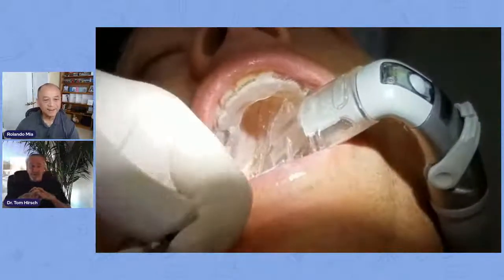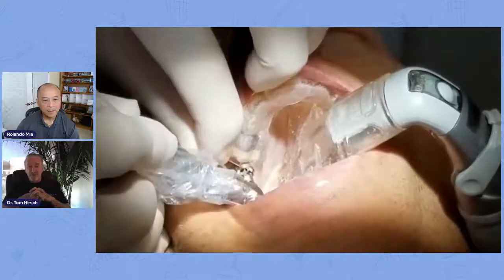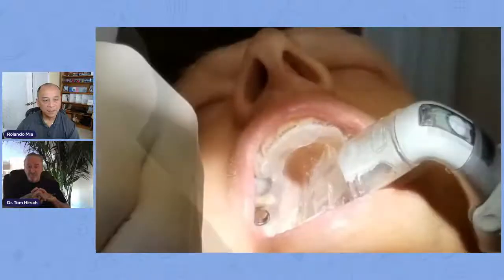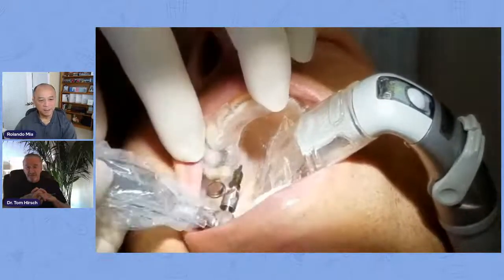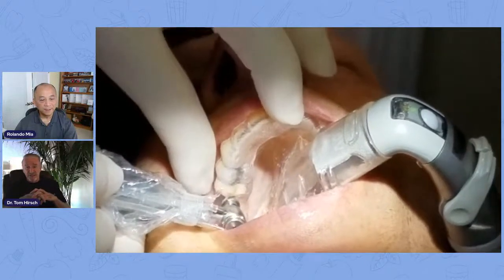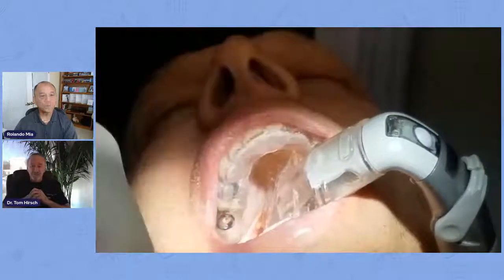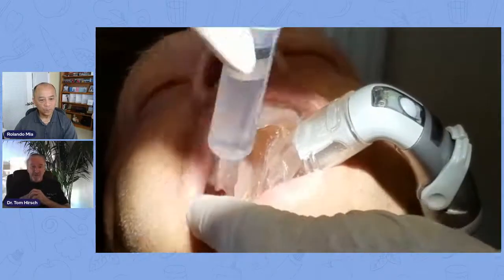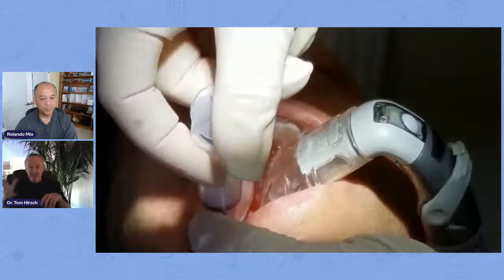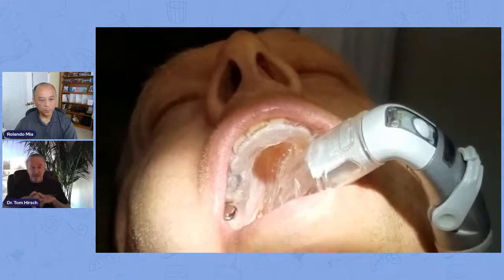Going up to the 4.3 — I think I put an 11.5 millimeter implant in here. Irrigation. Change the sleeve. This time I didn't need a sleeve since it was my last osteotomy drill. I go right to depth. What's nice about this is I don't have to worry about going too far — when it's guided, you just don't have to worry about that. We irrigate the socket. This is real time — you can see the water and the blood being evacuated right up with the Isolite. There's just not a whole lot of bleeding here, which is really nice.